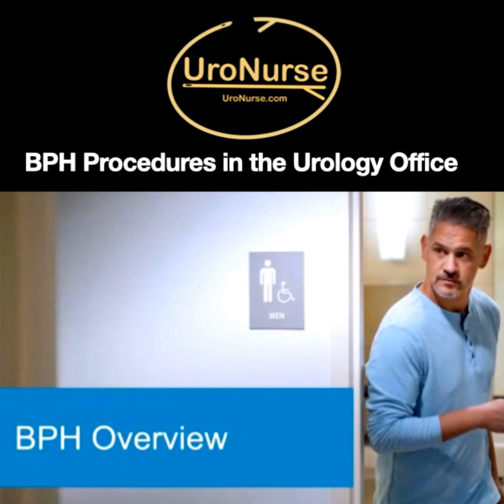Side effects from the Rezum, basically what I've mentioned. Obviously, you can go into retention, clot retention, UTI, and we do see that periodically. You've got to be judicious with leaving the catheter in and how long you leave it in. I personally leave it in for about 3 days, and I will have the patients take the catheter out themselves at 3 days.